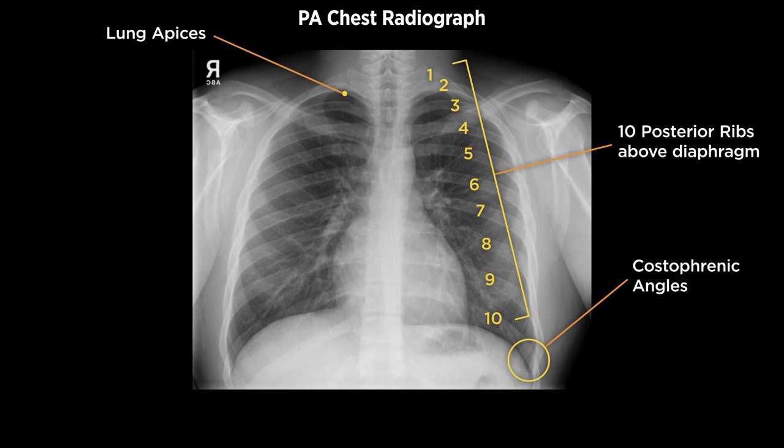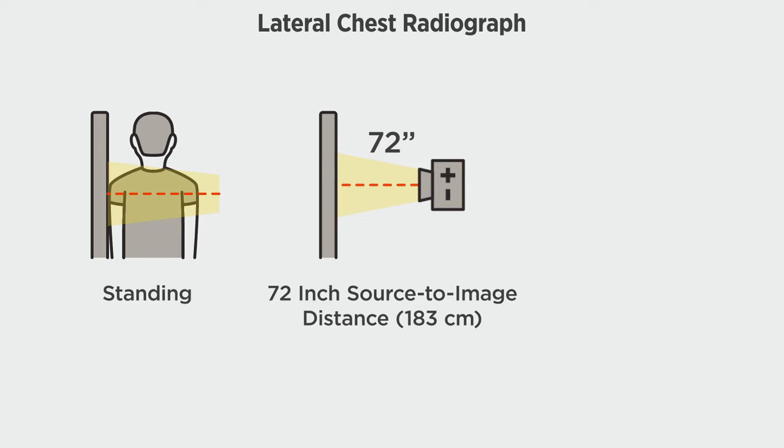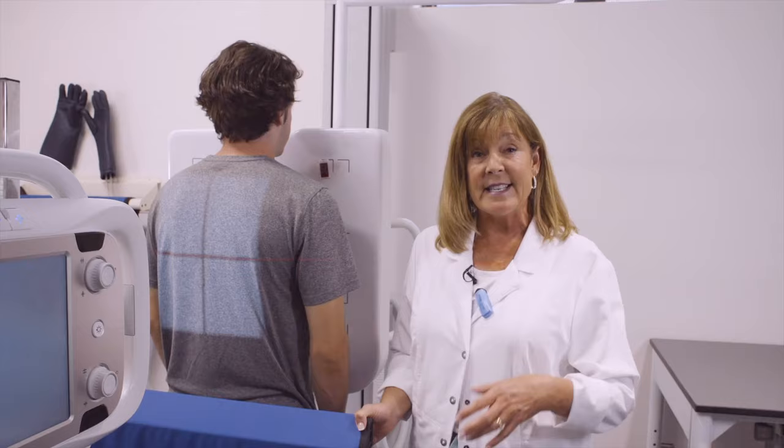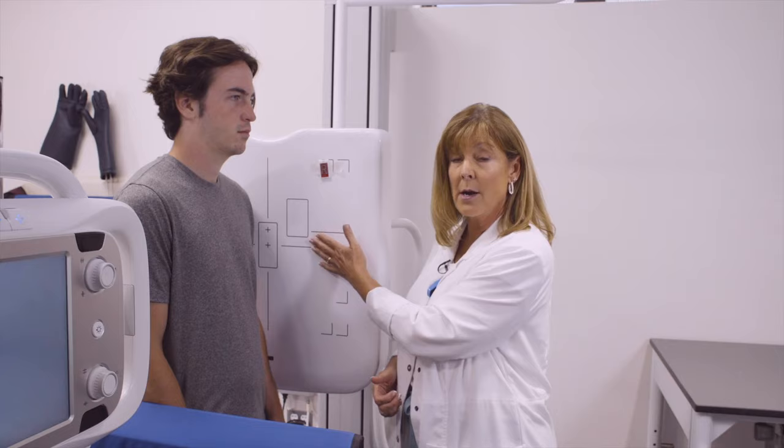In this view we will be demonstrating the lateral upright chest. The lateral chest should be performed with the patient standing at the upright bucky with a 72-inch source to image distance and no tube angulation. The next view is a left lateral, so I'm going to have my patient turn towards me. The left lateral is most important because our heart dips to the left — we want that closest to the IR to reduce magnification, and the 72-inch SID also helps reduce magnification of the heart.